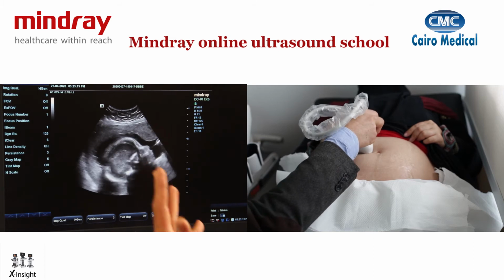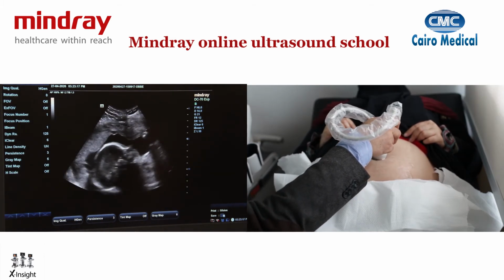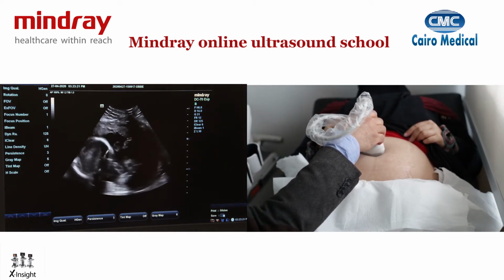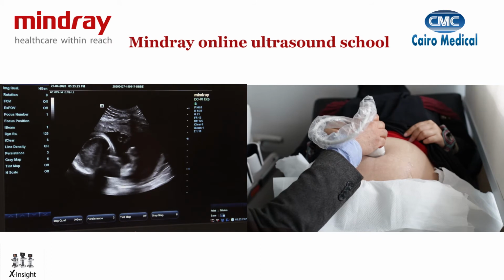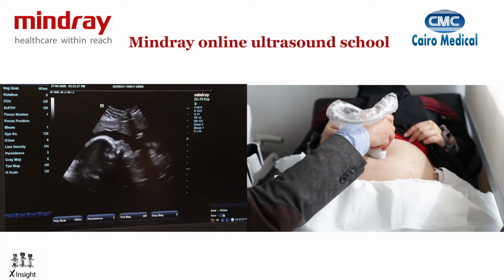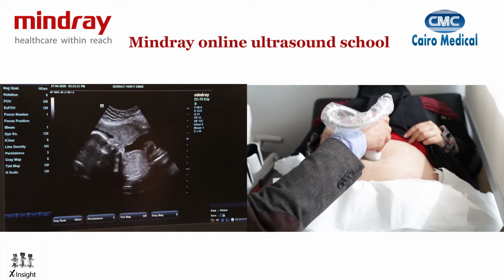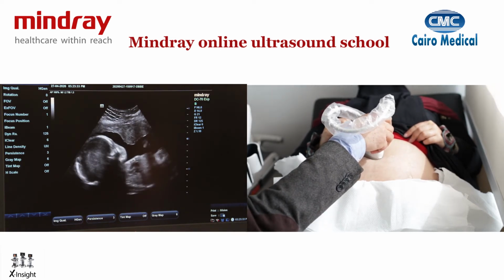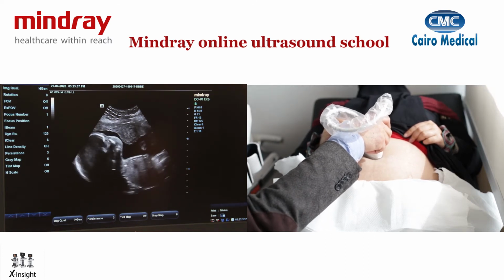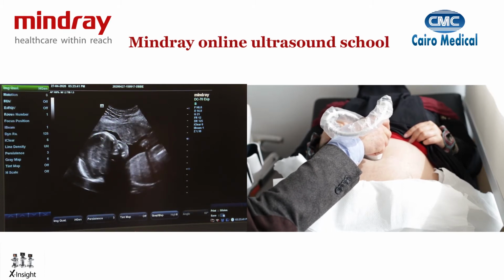The baby is actually facing upwards, so I'm going to utilize that for now, because I might not be able to get it again before we do the biometry, and I'm going to do some of the 3D surface rendering. As we explained in the lecture, when we do surface rendering, we're actually doing 3D to get information on the surface. It's a quick acquisition of volume. It doesn't take a lot of time. It's actually just giving you information on the surface of the baby without going through the base of the baby. So I'm going to get a view of the baby's face.